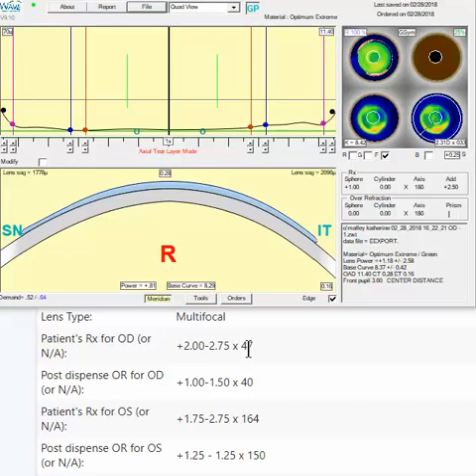In most cases, if you have an over-refraction that is consistent with the spectacle refraction, you can feel pretty confident in adding in the over-refraction using the over-refraction tool button. If this patient is seeing well already with the lens, I may recommend not adding in the full amount, possibly taking the spherical equivalent, maybe knocking that down to 1 diopter cylinder and maybe plus 75 or so.